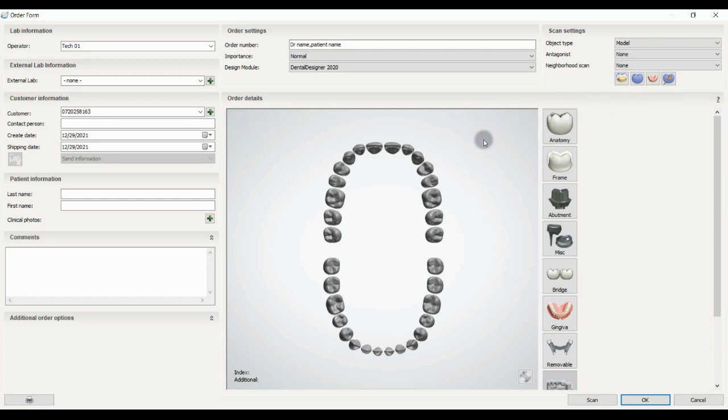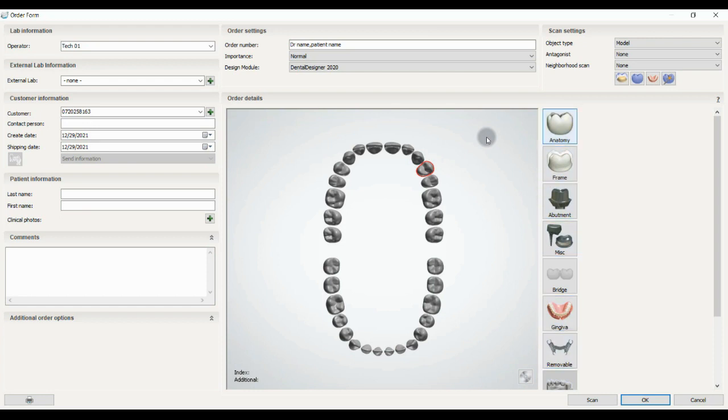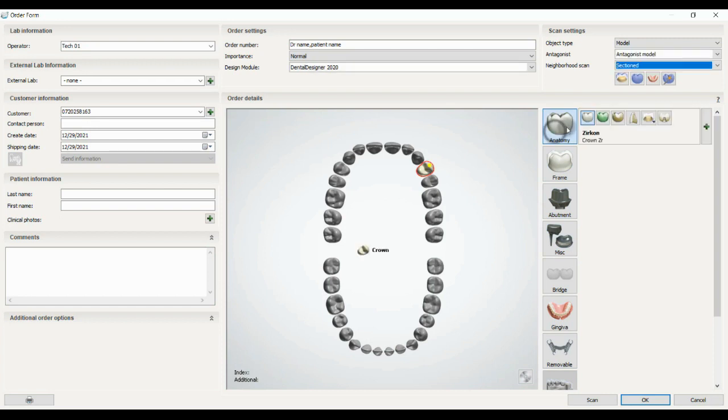Okay, and the important one: first you have to choose the number of the tooth that you want to work on. For example, in this case it's premolar, and you can use these options to work on it.